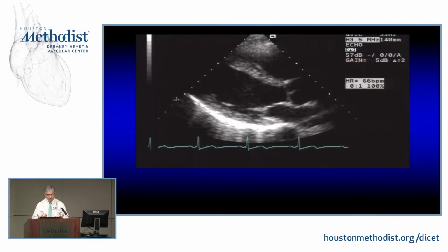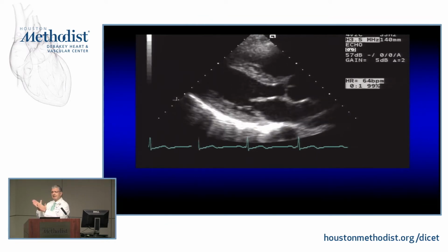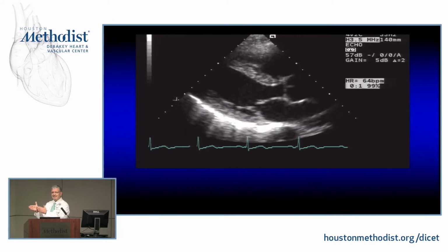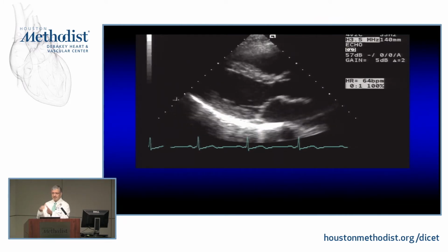Now, how do you put a 2D image? Well, you put a 2D image by thinking along the line of, remember my scan line, now I move my scan line next, and then next, and then next, and then next within a sector. And then I'll do it again, and I'll do it again.